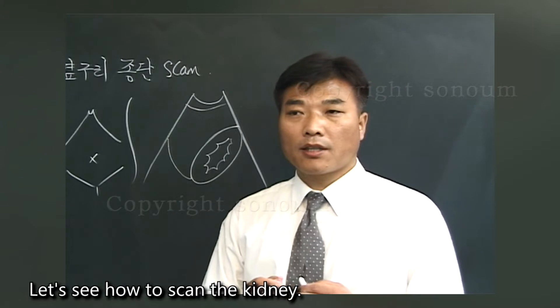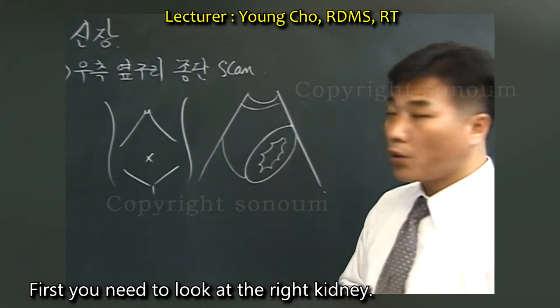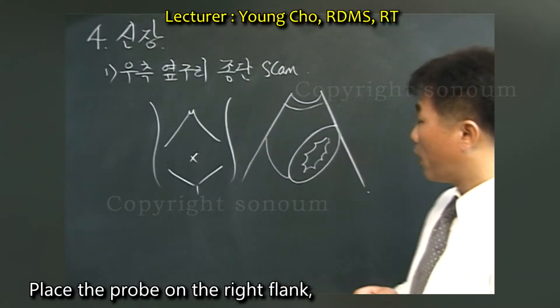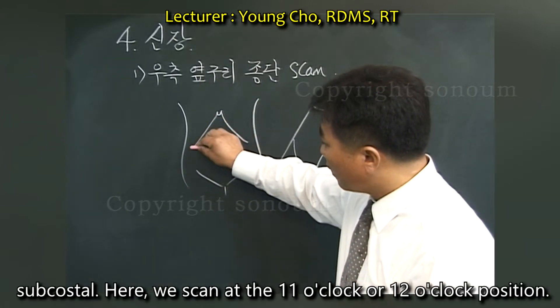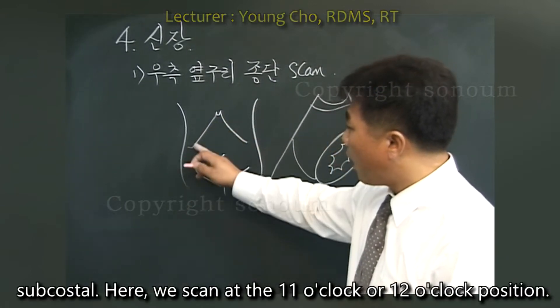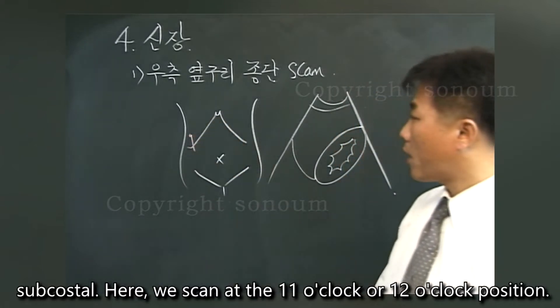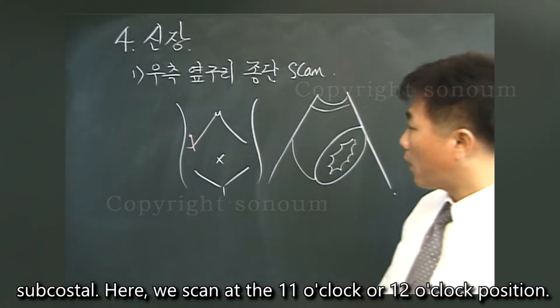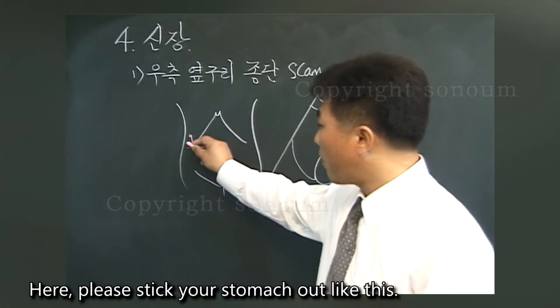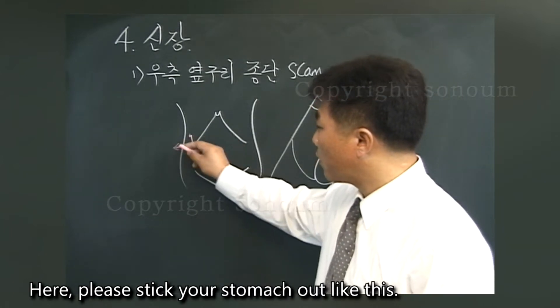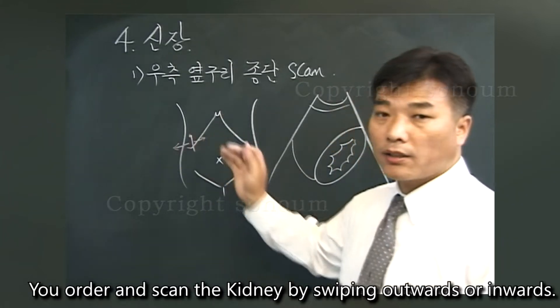Let's see how to scan the kidney. First, you need to look at the right kidney. Place the probe on the right flank subcostal. Here we scan at the 11 o'clock or 12 o'clock position. You order and scan the kidney by swiping outwards or inwards.